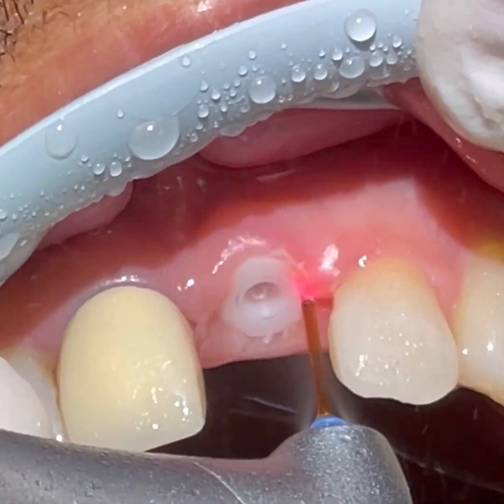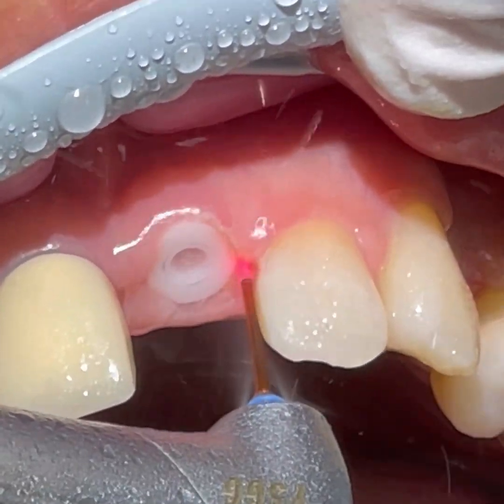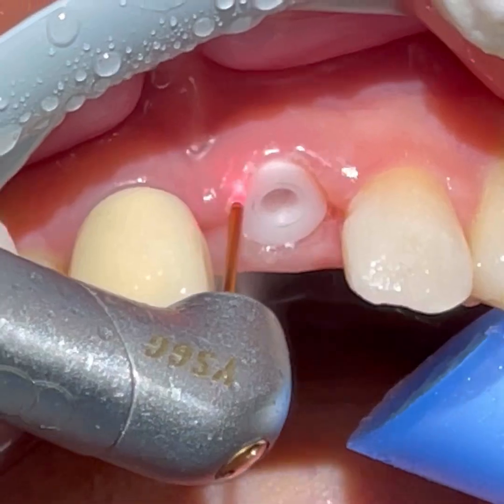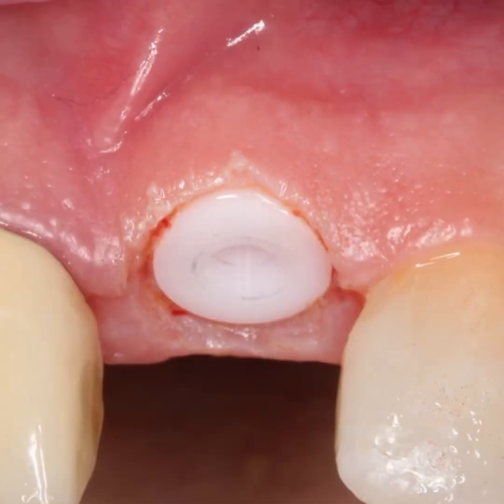Since this is a tissue-level implant, all we have to do is laser away the gums surrounding the margins using the Waterlase by Biolase. As we notice, there is absolutely no charring and we can gently sculpt the tissue so there is a nice emergence pattern.